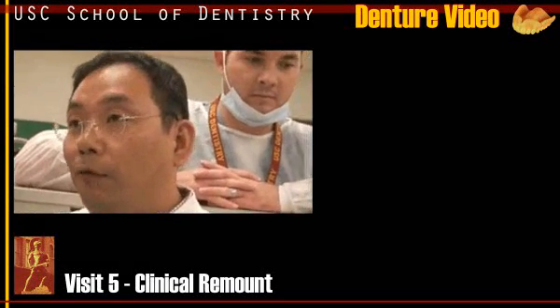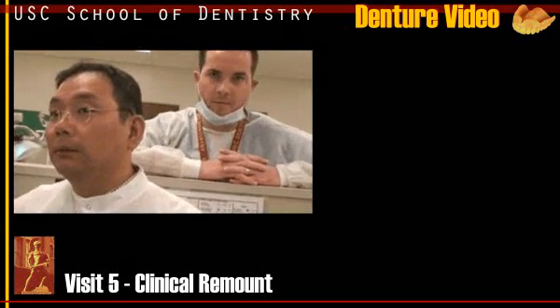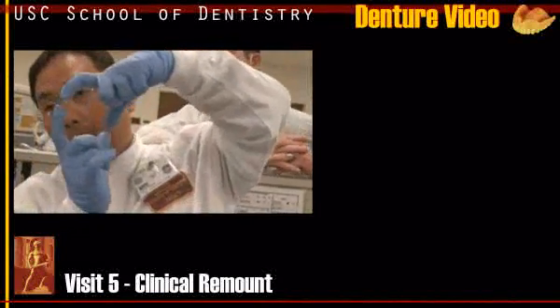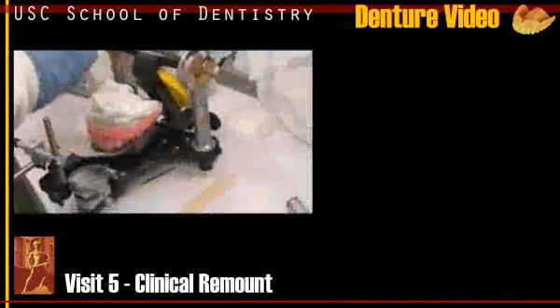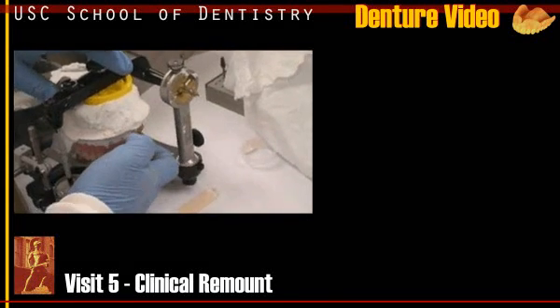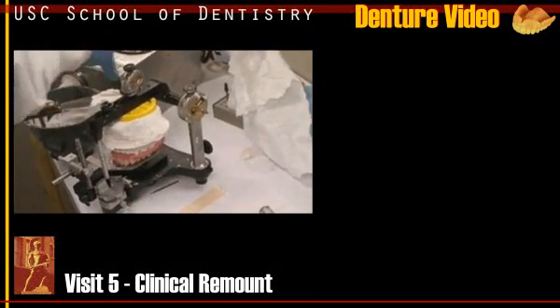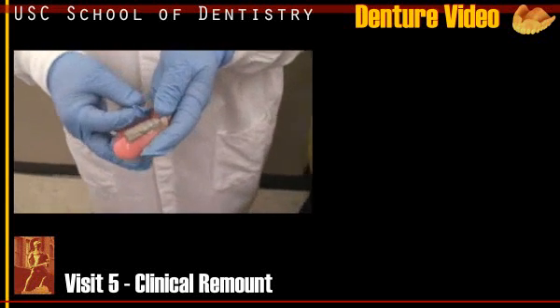Denture, unlike fixed, we are dealing with the soft tissue. So if we check the bite against the soft tissue, then it might be biting like this, all right? It might be biting like this, but with one area a little bit compressed. If I were to use the paper towel. Okay, that's maybe a little bit up. I'm pressing down, but that's not a big deal because I get the excess. And then you feel like this one is already cooled down, okay?